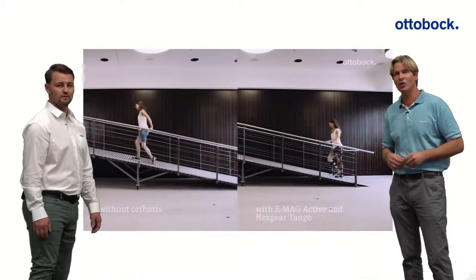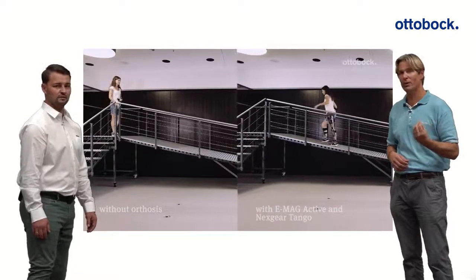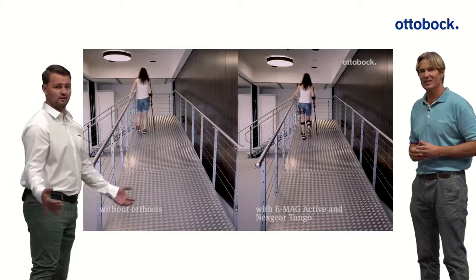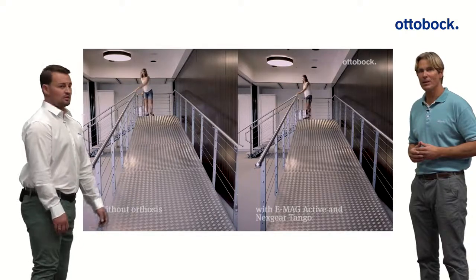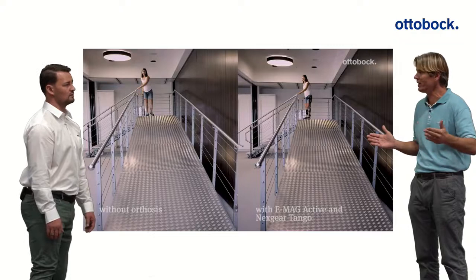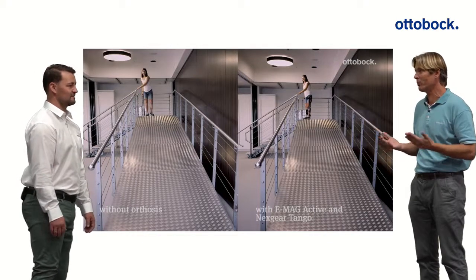On the ramp you can see her nice, upright upper body posture and she uses the energy return from the Tango spring to push herself up. Without the Tango spring, she uses her healthy side to compensate, but her affected side isn't helping. With the Tango joint she can now use her power more equally. Patients also report walking greater distances with the Tango joint, helping them achieve more in daily activities. It takes training though — physical therapy is a big part of achieving these results.